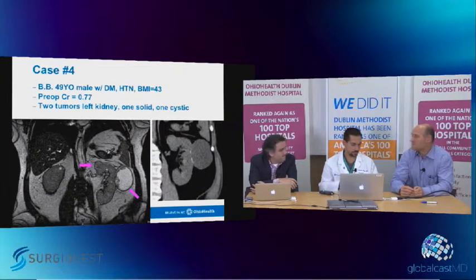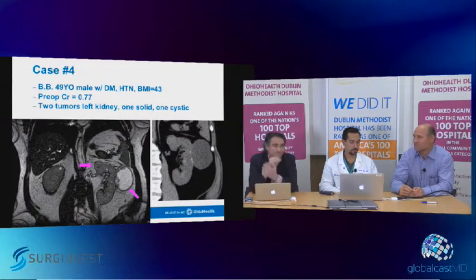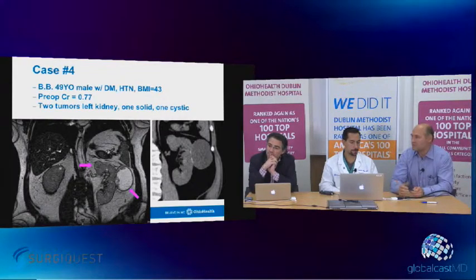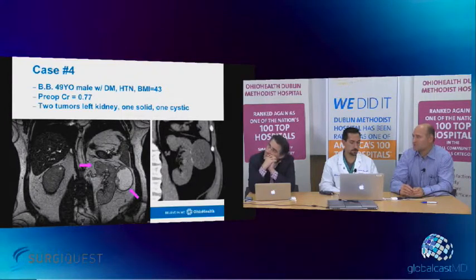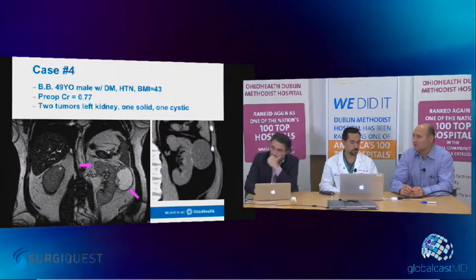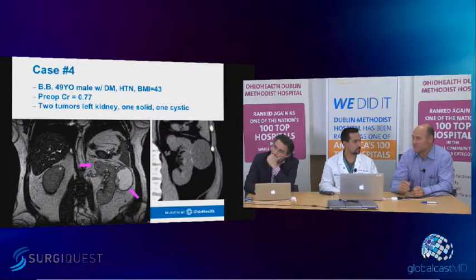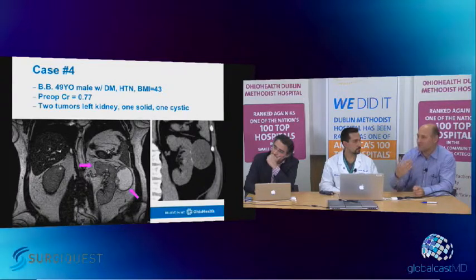But if you're coming after this upper pole tumor, would you go ahead and remove that? You know, you could, because what you see here is the plane, it's a reasonably shallow tumor, and that's really going to help with regard to your ischemia time when you're doing this other tumor. This other tumor is upper pole. It's not too deep. It's small. So yes, I would probably approach doing both of these at the same time as a partial nephrectomy. Again, clamping the entire kidney, and be prepared to have the kidney very mobile so that you can go back and forth and be able to have good access around the entire kidney.